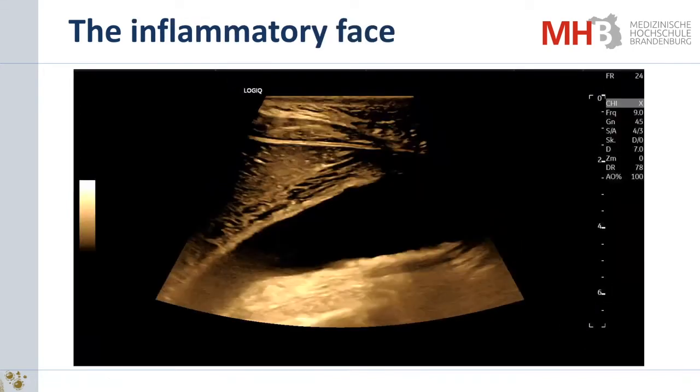One of our participants wrote cholecystitis. I think that's a severe cholecystitis. Yeah, do you agree? It was really a severe cholecystitis. Yeah. The patient was very ill and was a bad situation because she had this small daughter of 7 days and gave her milk, but she had to be operated.